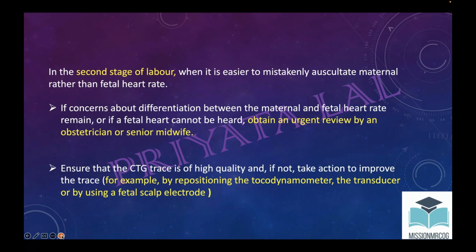Now you can understand that in the second stage of labor, doing a scan will not be a feasible option when the patient is pushing. At that time doing a scan is difficult. So this way you will sort out the issue in the second stage of labor if you are listening to the maternal heart rather than the fetal heart. Okay, this was just the basic thing.